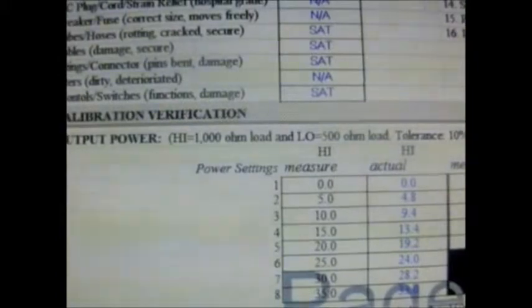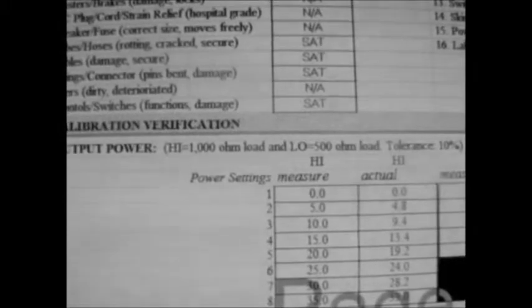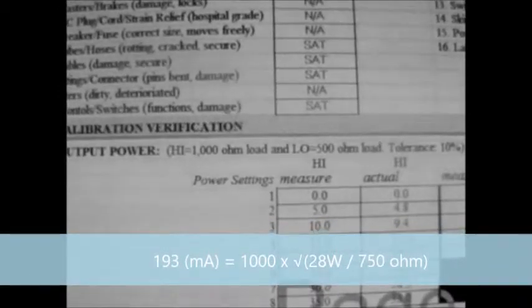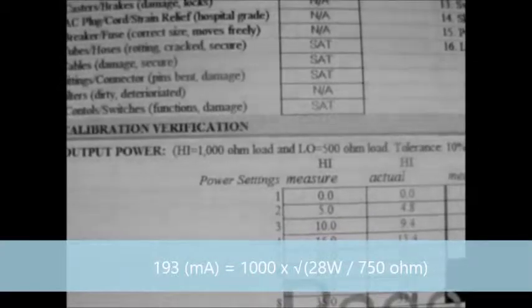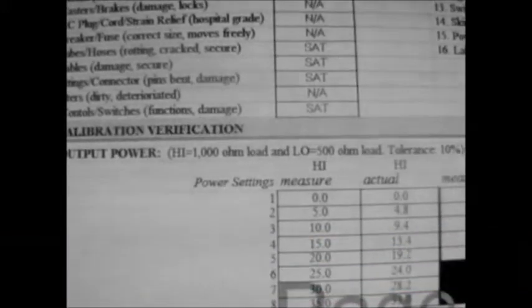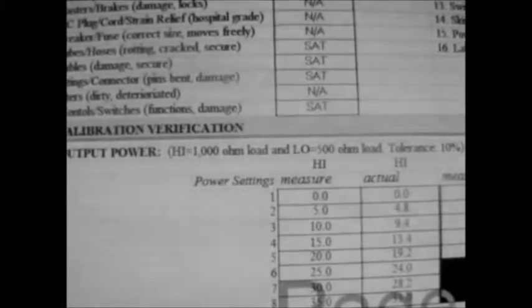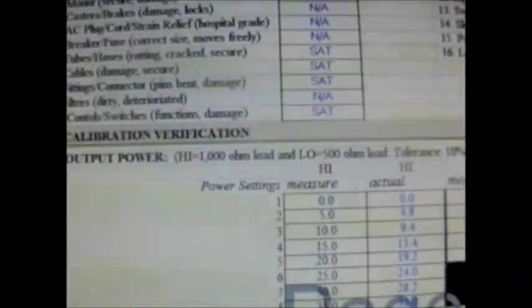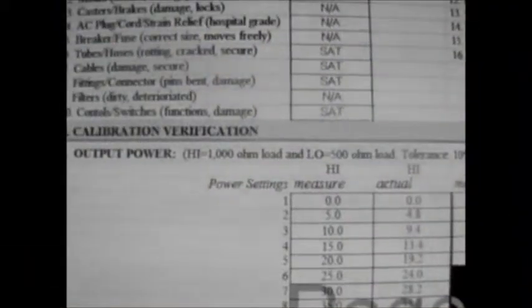For example, if our analyzer's maximum test load requires us to calculate new mA ratings, we replace total power at the maximum setting of 28 watts and divide by 750 ohms, our new resistor load. We take the square root of that and multiply by 1,000, which equals 193 milliamps. We perform this test to ensure linearity and percentage of accuracy — that the integrated current reproduces actual power settings on the display and is within manufacturer acceptable units. Power output is measured in watts.